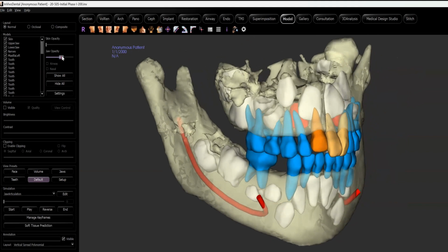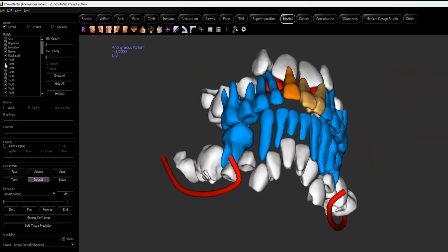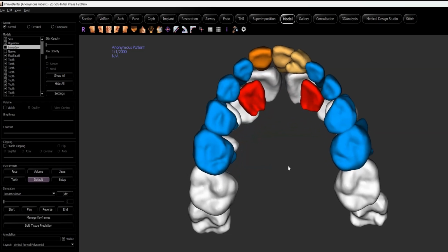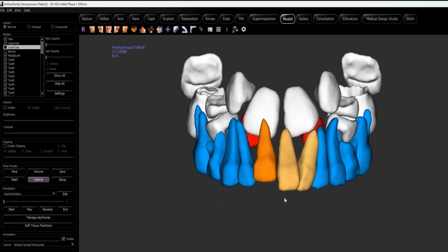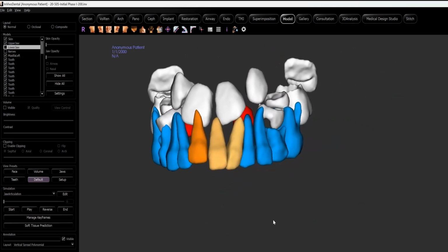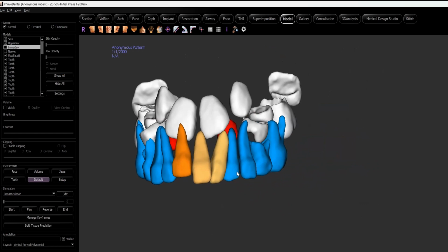You can see here, you're wondering way in the back why that tooth is red. Well, clearly that's just removed. So you can see how I'm interacting with the data, right? And dissecting essentially the patient. So you can see how these are supersized, ectopic, permanent maxillary lateral incisors. Where are they? You can see this patient has supernumerary primary incisors, okay? So you can really start to see. And we're going to talk about a particular use of this technology for identifying supernumerary teeth, which are the real ones, which are the culprits, et cetera.